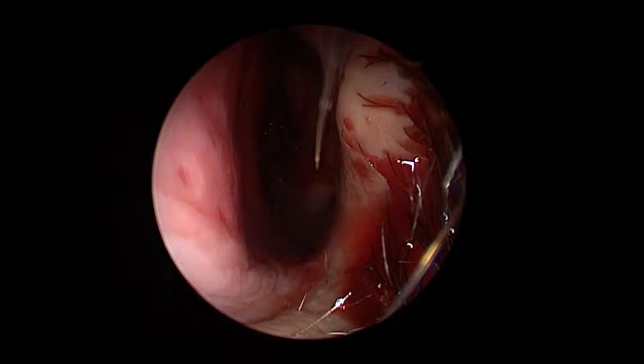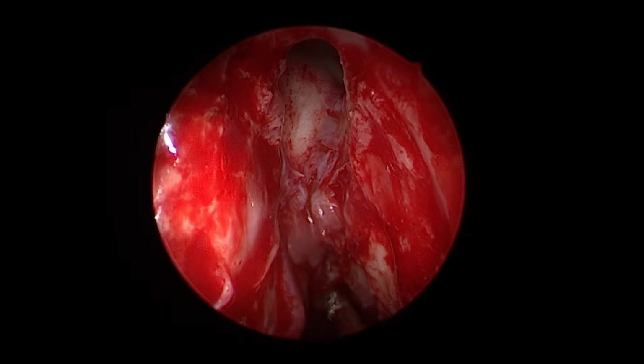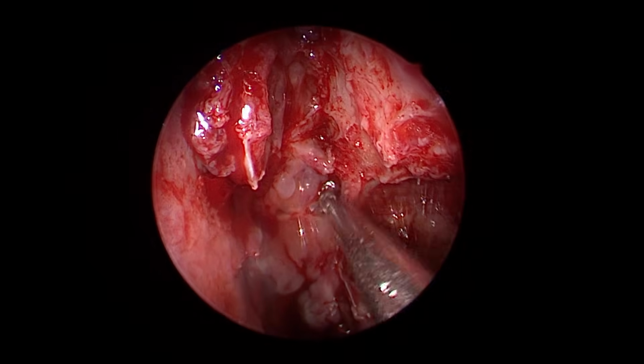Will you like to debride that mucosa in the frontal? No, that is so healthy. So healthy, lovely mucosa.